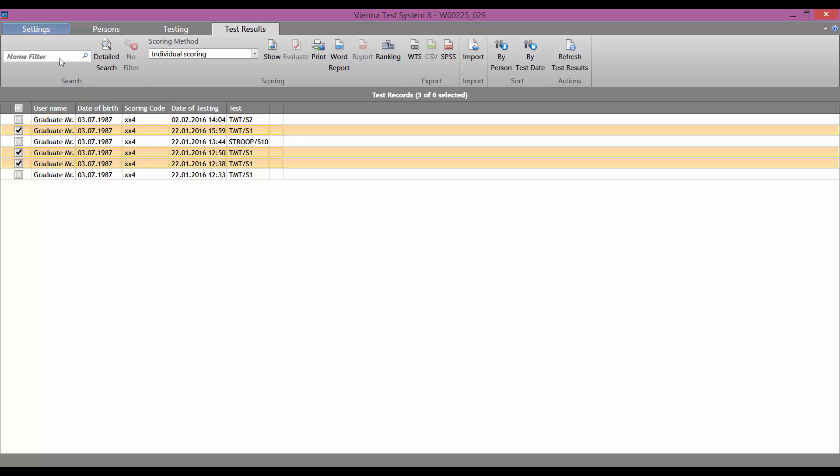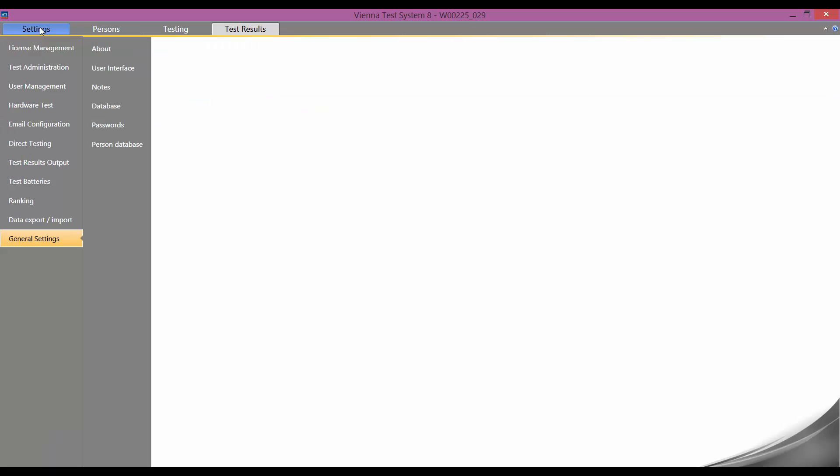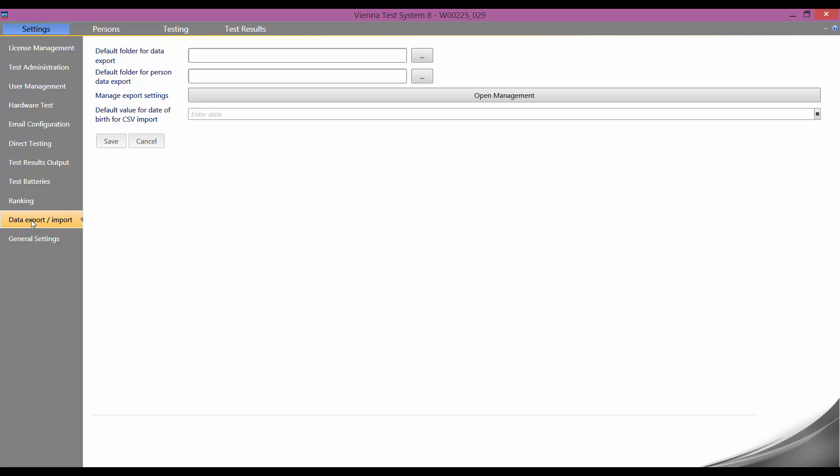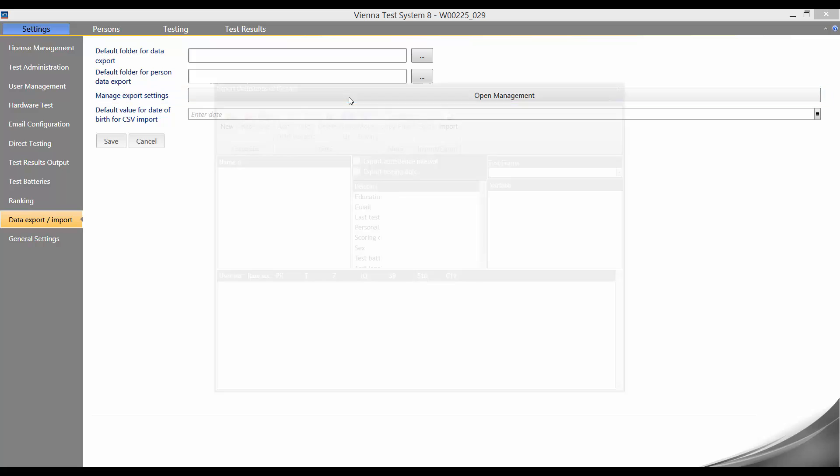To do this, we need to go to the settings tab. Here we need to click on data export import and then on the open management button. In the next step, we are going to create an export profile for the Stroop test interference test.